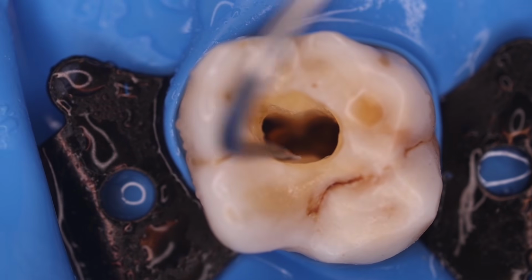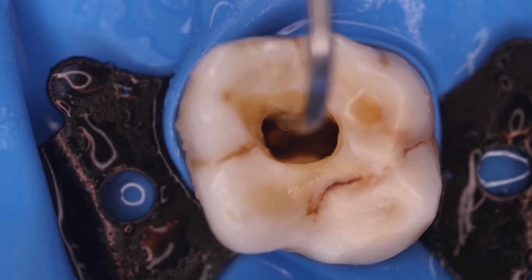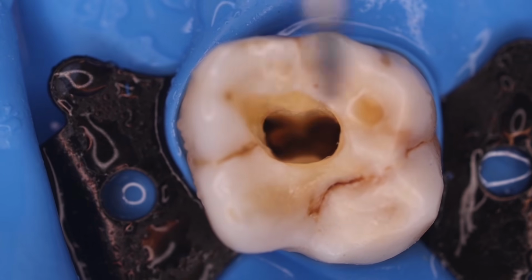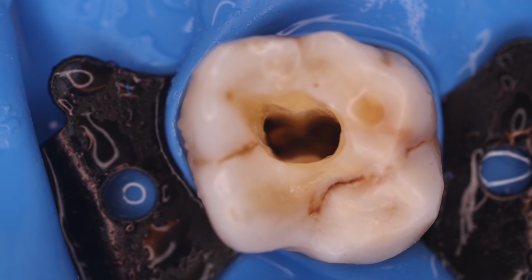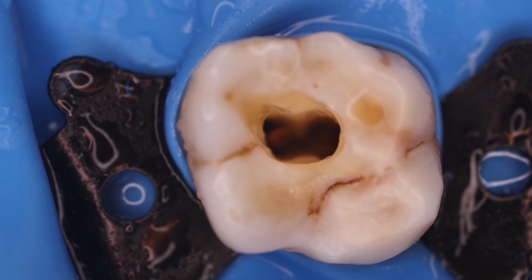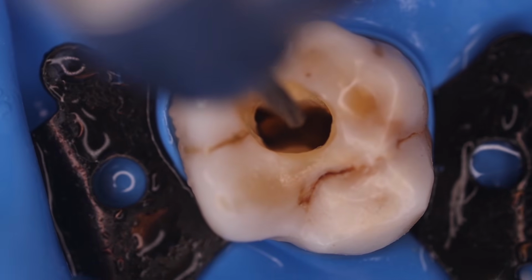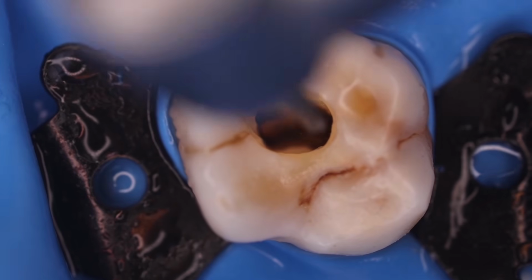Hope you can now appreciate the access cavity shape that we are preparing with the help of the Endo-Z burr, and we are able to locate the canal orifices. A better choice for orifice location would be the DG16 probe. Define the access cavity shape in a proper way so that we can easily locate the canal orifices.